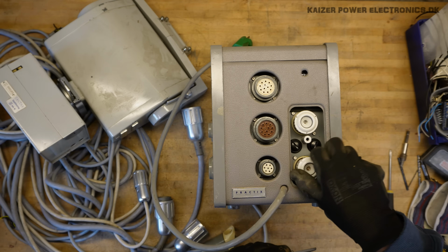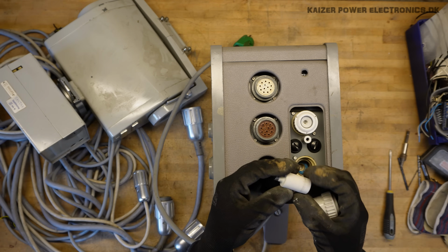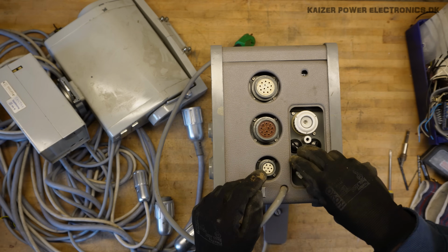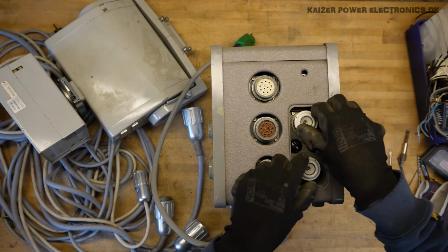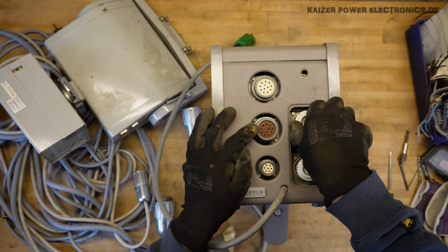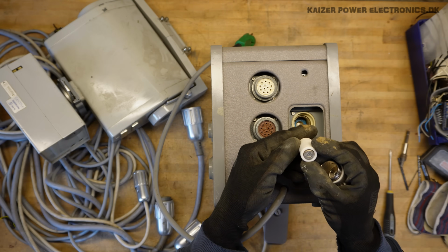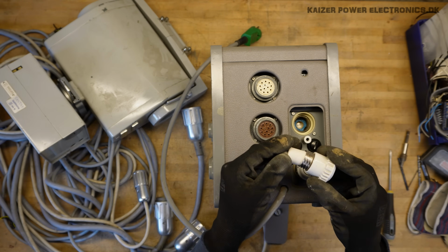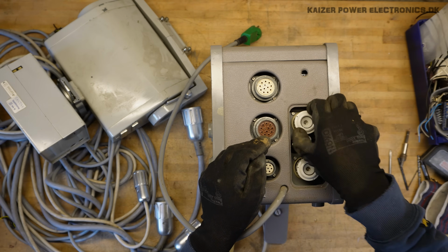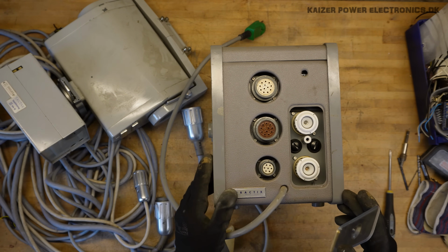Nice big ceramic DO0 fuse holders. Let's see what's rated. No text there, I think 15 amp for that one. And another 15 amp for the other one here. Maybe it's actually D00 fuses. Oh well. Nonetheless, nice old ceramic fuse holders. They can burn red hot and it's not an issue.